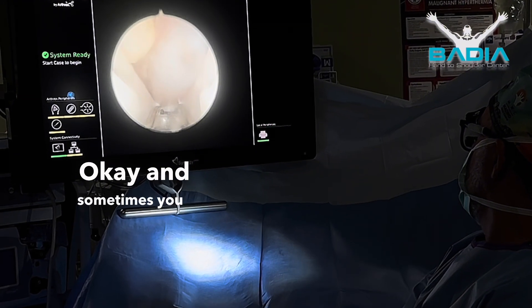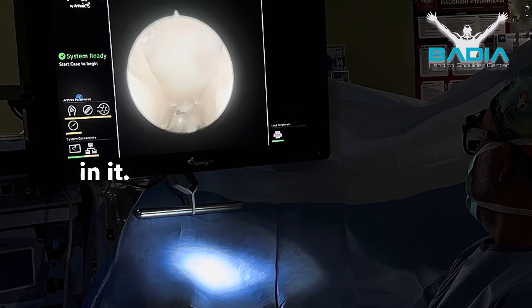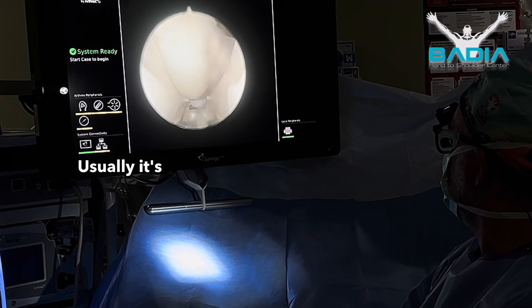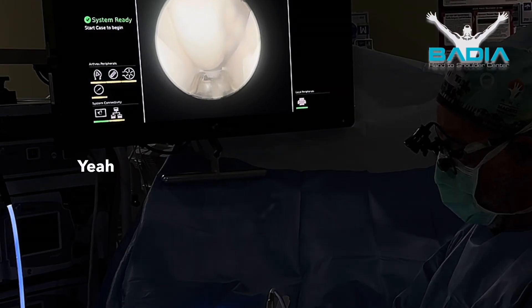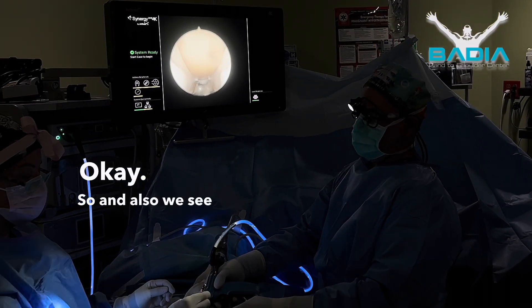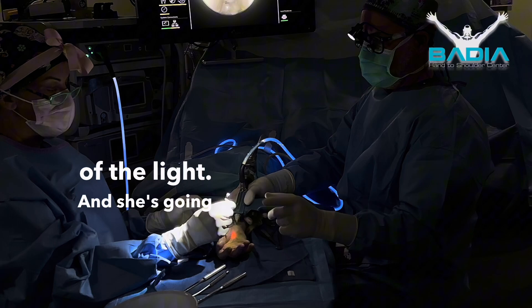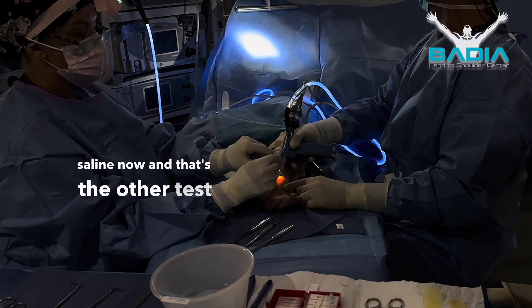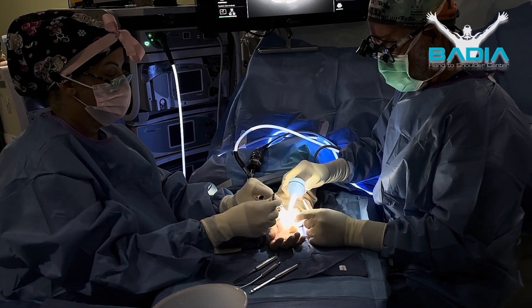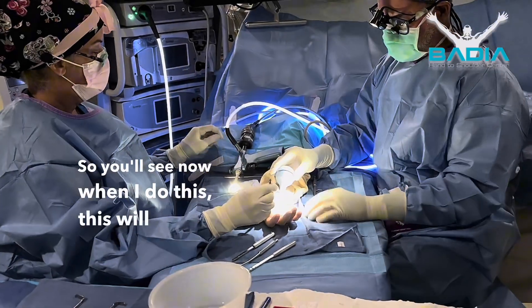Sometimes you can see a little artery in it. And if we look to the ulnar side, there's the flexor tendons — usually it's either the middle or the ring. So that's the middle flexor. We also see the transillumination of the light, and she's going to give me some saline now. That's the other test that we released it sufficiently.